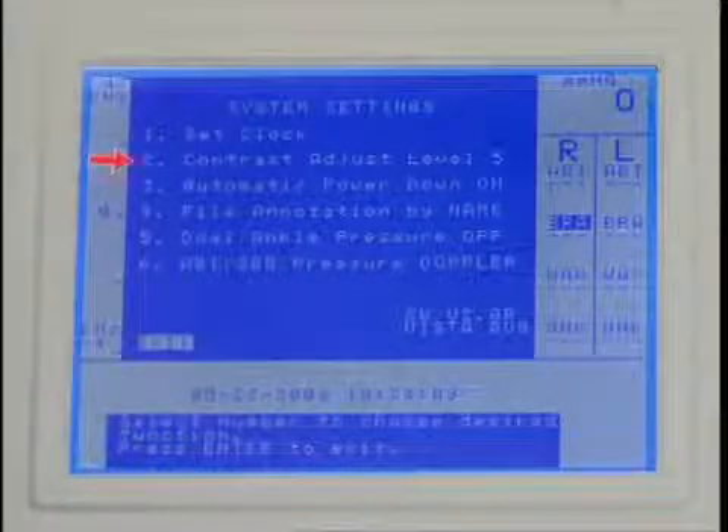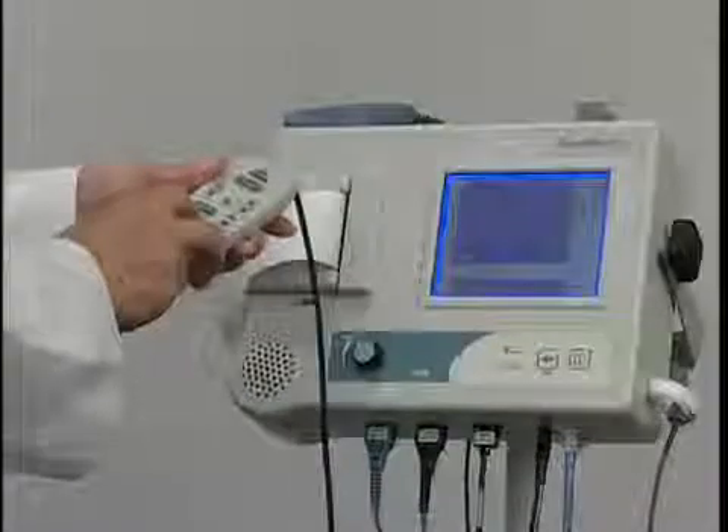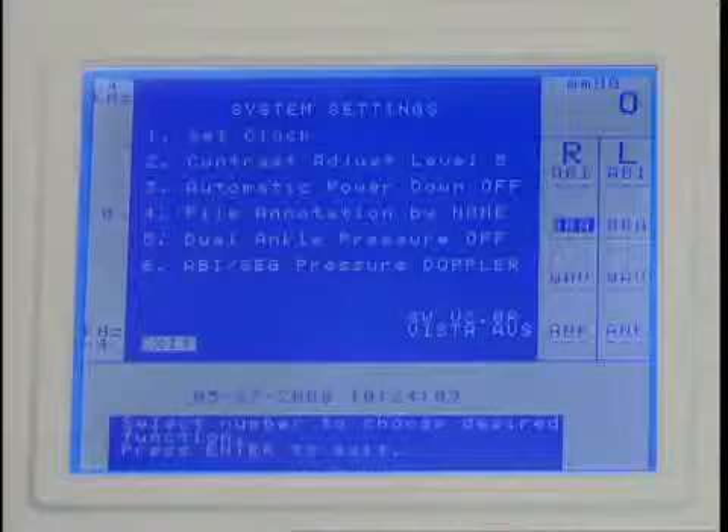The second setting determines the display contrast level. Press 2 repeatedly to change the contrast. When the appearance is optimal, save the setting by pressing enter menu or by selecting another menu item.